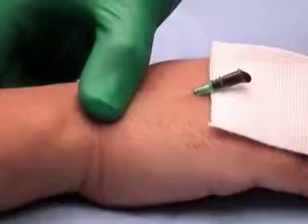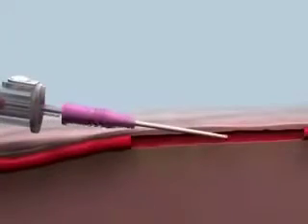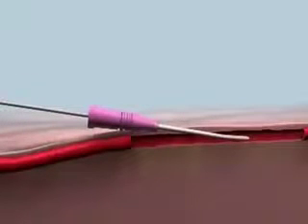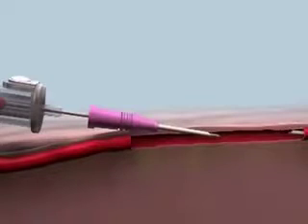Remove the metal needle from the plastic cannula and place it in the sharps container. Never attempt to reinsert the metal needle into the plastic cannula. Doing so may shear off the plastic cannula, releasing it into the bloodstream, resulting in a possible embolus.